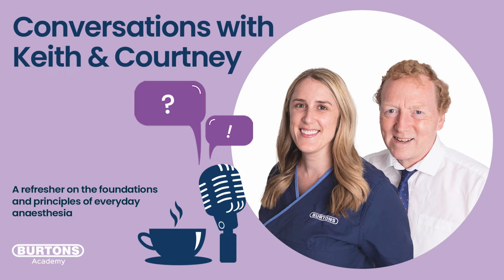So the anaesthetist there would say, okay, this drop in cardiac output isn't because it's suddenly gone hypothermic. That's stable. It could be because it's excessively breathing, but I can see it's not. So we must have a cardiac output effect. Just by understanding what those three compartments do, you can predict how things change. And the way we pick up that change is in the end-tidal CO2, by picking up the CO2 value in the expired breath.